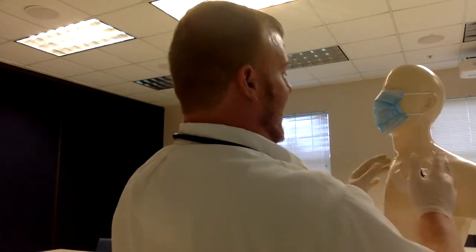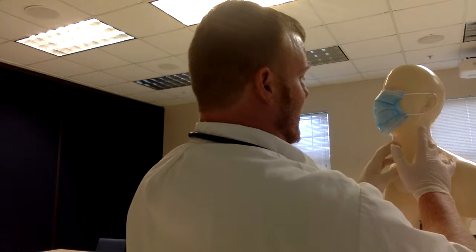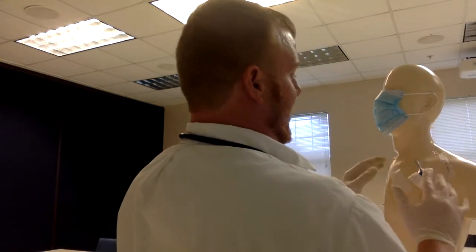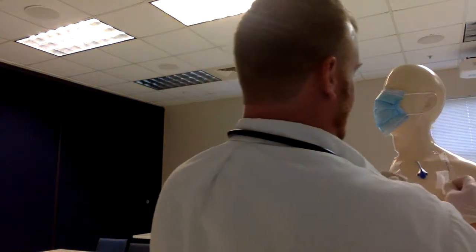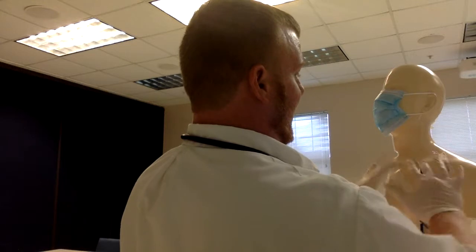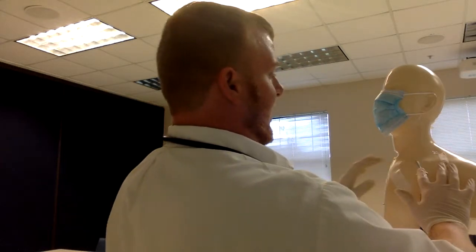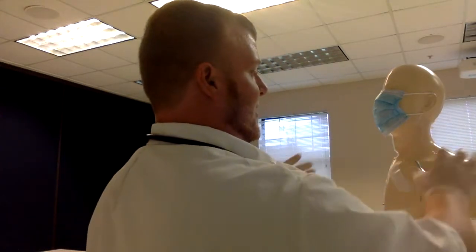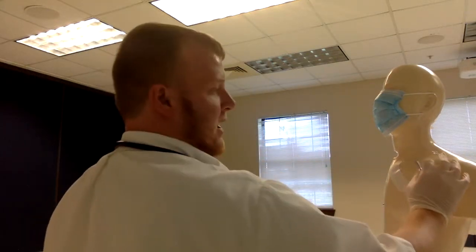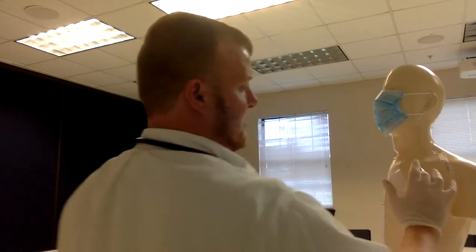I'll peel everything off. I'm left with just the catheter itself. I'm going to hold it at all times, and leave it for now before I completely prep it.